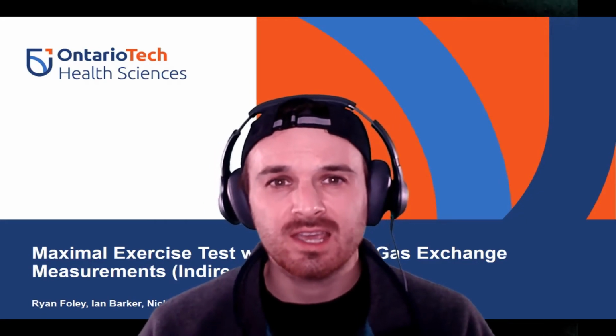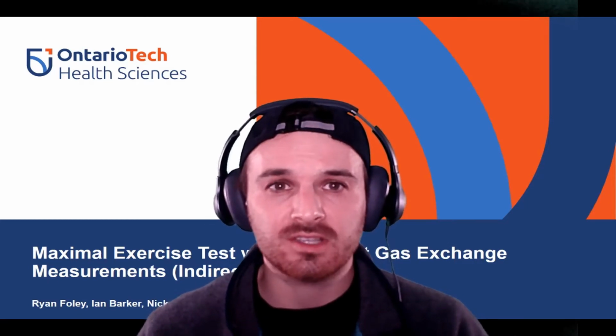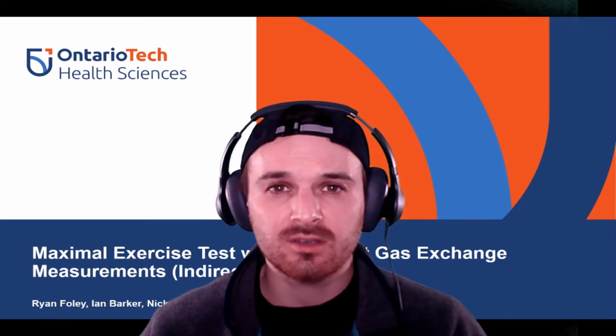Okay, so for today's video, we're going to be talking about an indirect but maximal exercise test. Sometimes people will say that a gas exchange analysis is an indirect test because you're not directly measuring the actual exchange of oxygen and CO2 at the cellular level or the production of lactic acid in the muscle. So that is, quote unquote, an indirect measure of ventilatory threshold.